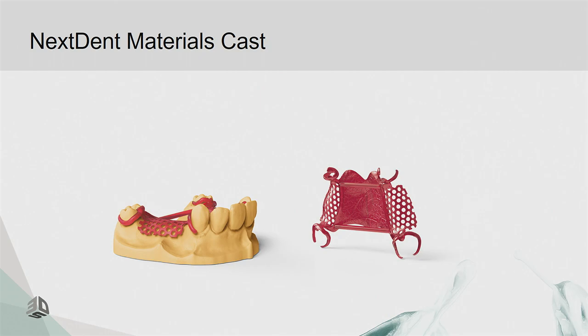Very important that you use an investment material that we've tested, meaning that in our IFU we give several options in what material to use in order to get a good end result. Because with casting, it's not only printing, it's also the actual casting part that's very important.